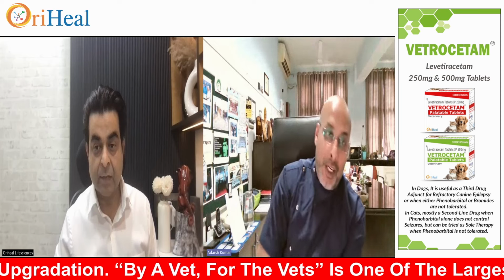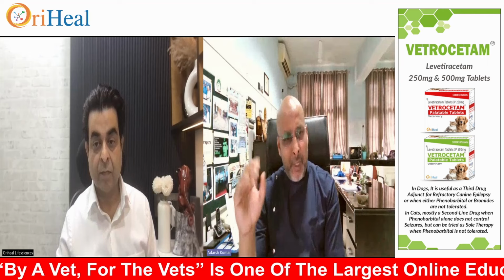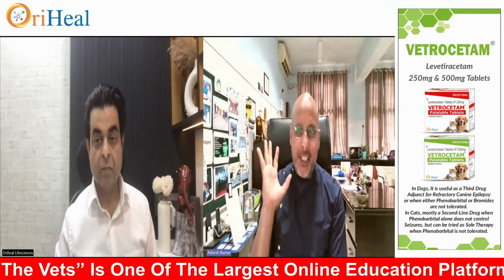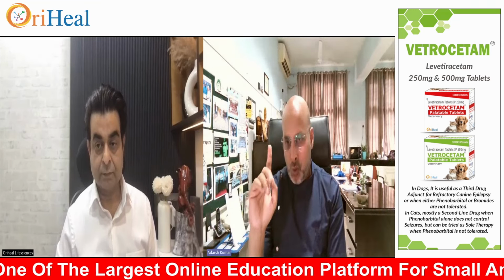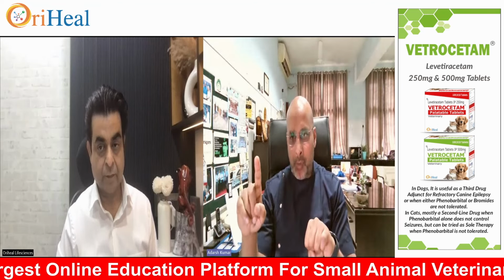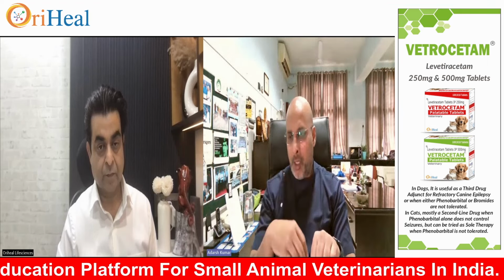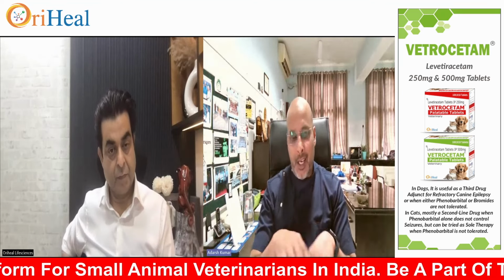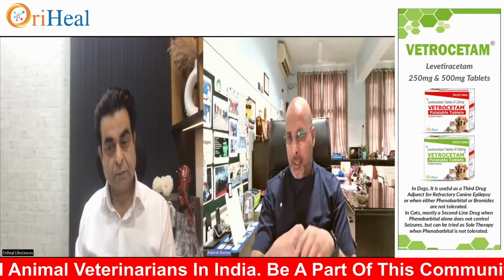What can we do about enamel resorption in dogs? See, enamel resorption can occur. It is also very common. Once the enamel is resorbed, that means the dentine is exposed. Now, if dentine is exposed, that means the animal is feeling some kind of pain. So what we are doing is, if it is on the tip, we are doing a crown amputation and restoring it. Otherwise, this animal cannot be restored. Animals don't grow the tooth back. But then freshen the area and you can restore it with the help of a composite. Okay, I'm going to cover this in the next webinar.